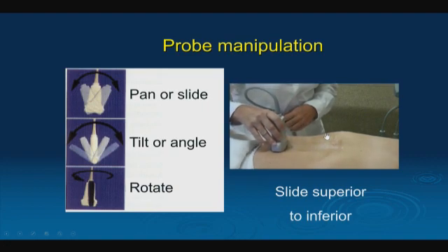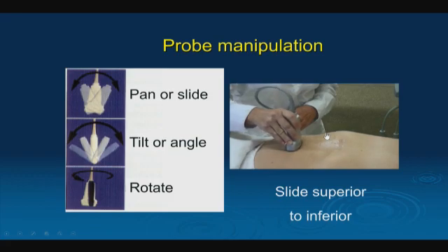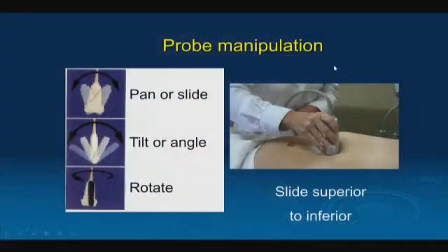You don't want to slide and angle at the same time. If I do that, instead of just taking slice, slice, slice, slice, slice, like we should be taking little slices to the structures, if I slide and move, I'm just off, I'm totally out of it. So you don't want to do big angle and slide at the same time. It's one or the other.